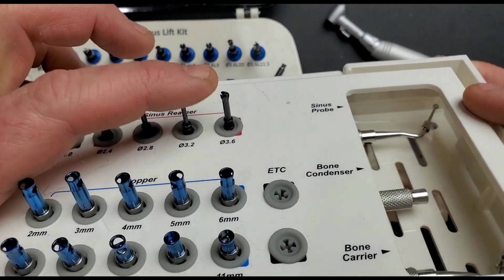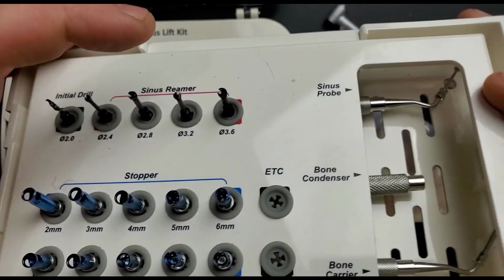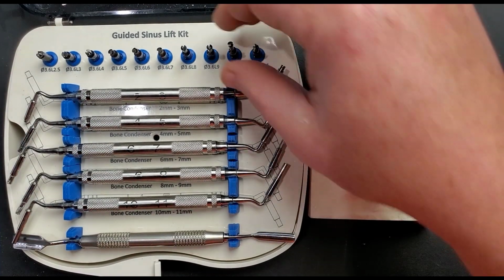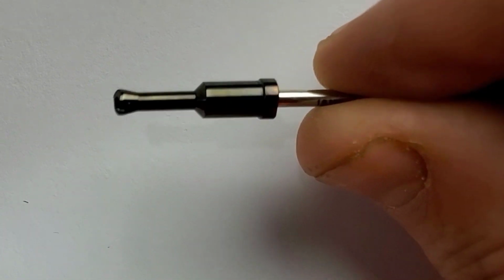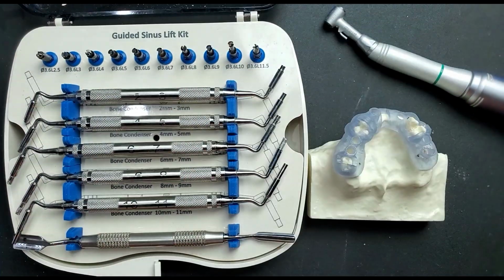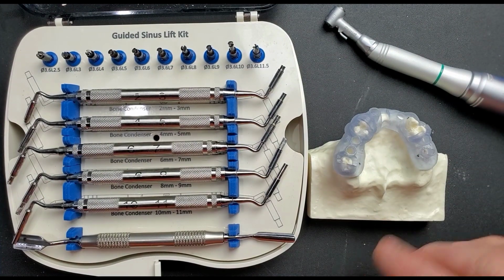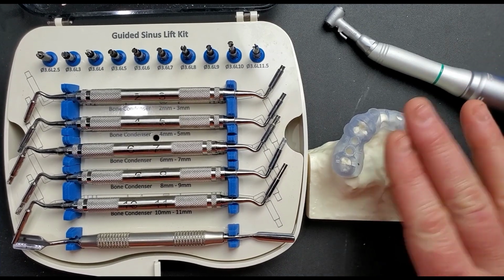You know, you have the Neurosurgical Burs, which don't cut soft tissue, and you have these drill stops that you would incorporate to control your depth. The difference with these is that this is still going to use the same neurosurgery style burrs. And you can see what these look like. These are designed to push a little bit of bone ahead of them without cutting the soft tissue. And so unless you put just a lot of excessive pressure and go way too deep on this, then you should be able to safely breach the sinus floor without damaging that membrane, complete your lift, and then place the implant. So let's go through a simple procedure on this model.